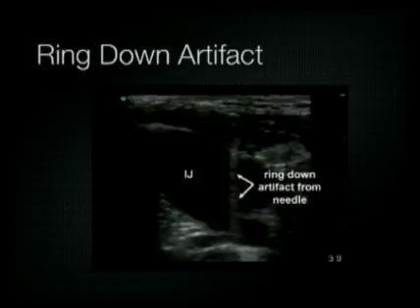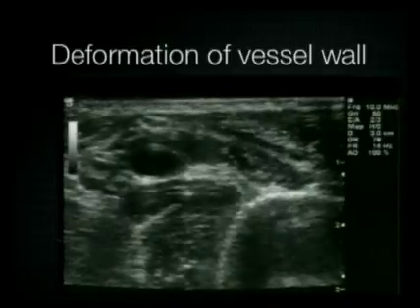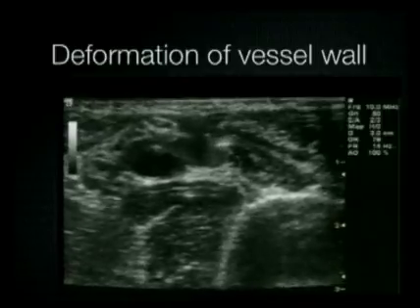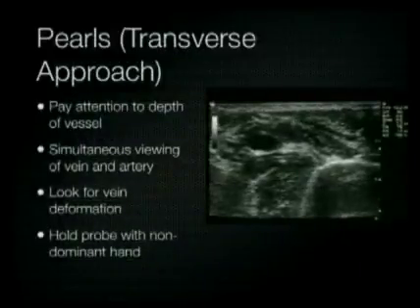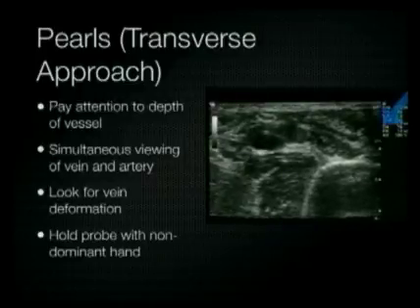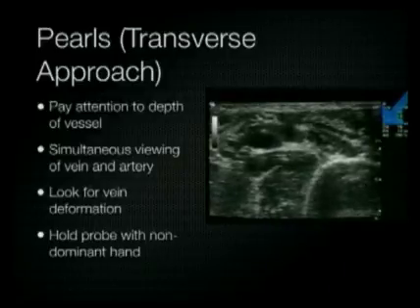This is an example of a ring-down artifact — it is a type of reverberation artifact, and it's helpful to determine whether your needle is in the same plane as the vessel. Because you can't visualize the tip of the needle in the transverse view, look for deformation of the vein as the needle penetrates the wall. One more thing to keep in mind is the depth of the vessel — as you can see here, the internal jugular vein is only 0.5 centimeters below the skin surface.